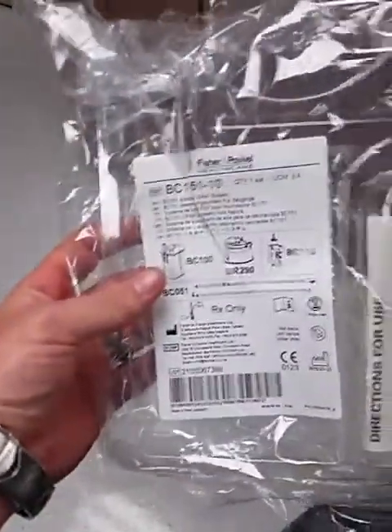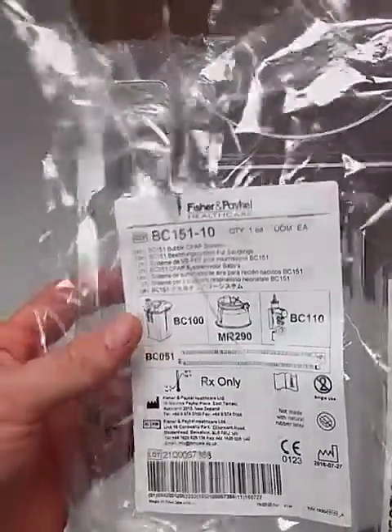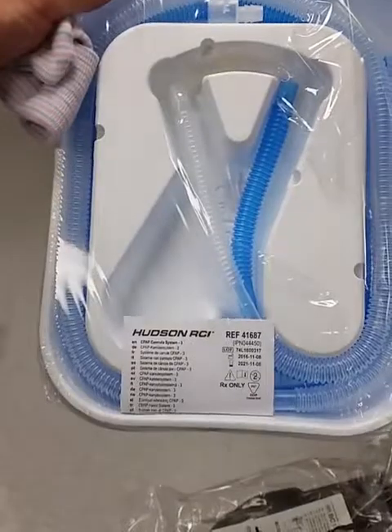Hey, it's R. Mitchell. I'm going to show you how to quickly set up the bubble CPAP systems that we got in the NICU. The items you're going to have to collect are the BC151-10 — it's a Fisher & Paykel bubble CPAP system. You're also going to have to grab the Hudson RCI bubble CPAP system.